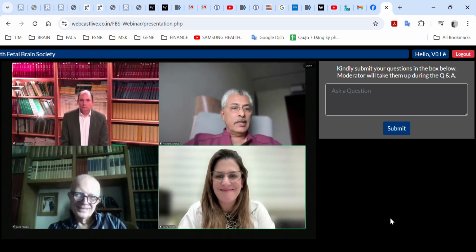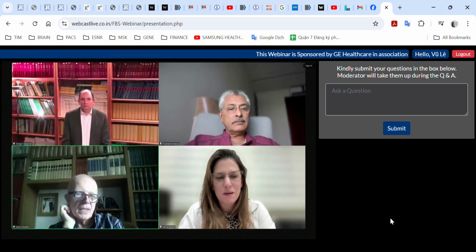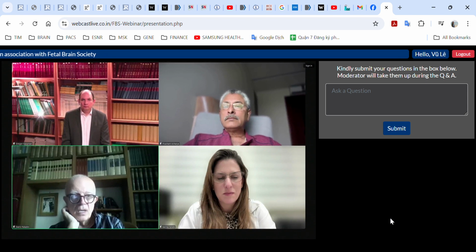Both. Gregor, do you want to... but it depends on the timing, because if it's less than 20 weeks, I want to listen to Gregor, but probably ultrasound is much better performing. And if you have to scan the second fetus pre-lasering in TTTS, given the distance from the cervix, you do not do transvaginal, and there's a lot of fluid.